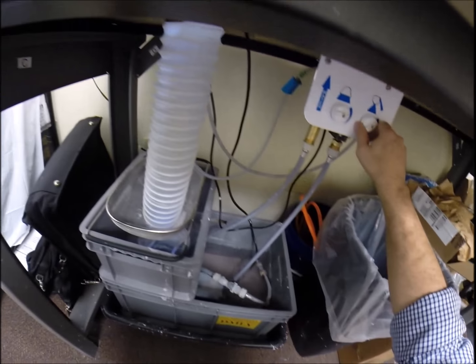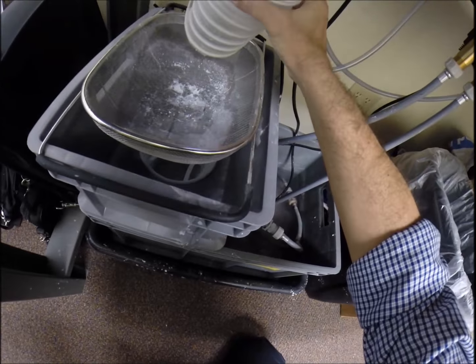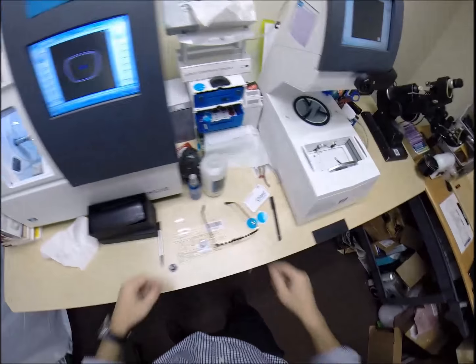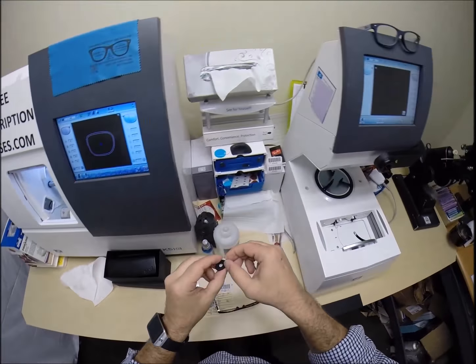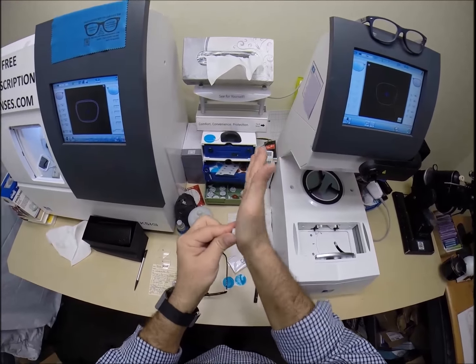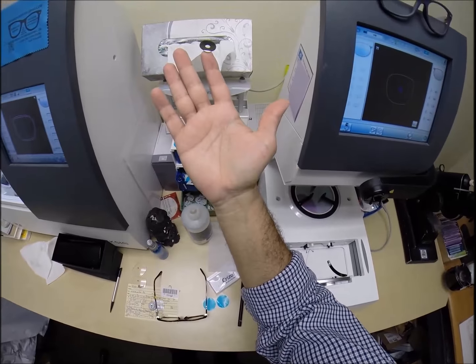If you see light flickering in the background, that is water there to catch the optical sawdust. Polycarbonate lenses cut dry, where plastic, high-index plastic, and Trivex lenses cut wet - meaning water is actually spraying onto the lens for the duration of the cutting cycle.